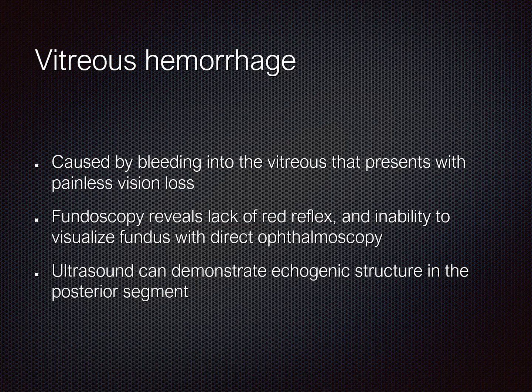The second pathology we're going to talk about is vitreous hemorrhage. So that's similar to retinal detachment. Instead of the retina detaching, it's the vitreous, which is the layer just inside the retina, often associated with bleeding because it's a very vascular structure. You see it most commonly in the elderly. Can also be traumatic, can be spontaneous, especially in people who are nearsighted. Again, it's a fundoscopic exam, the loss of the red light reflex and the inability to directly visualize the fundus. But on ultrasound, again, it's a little more obvious what you're looking at.